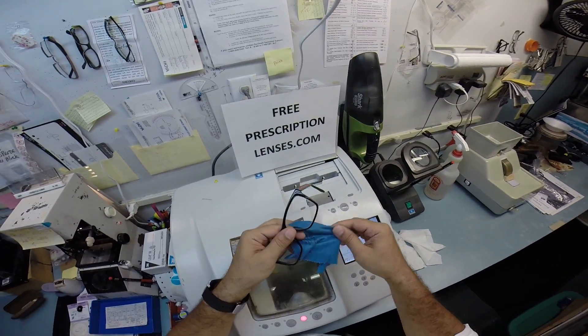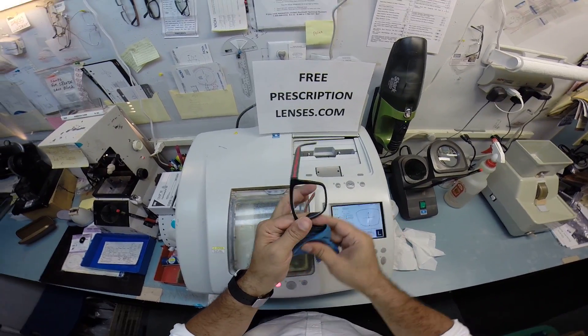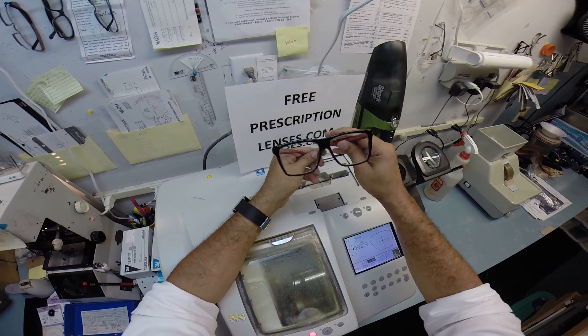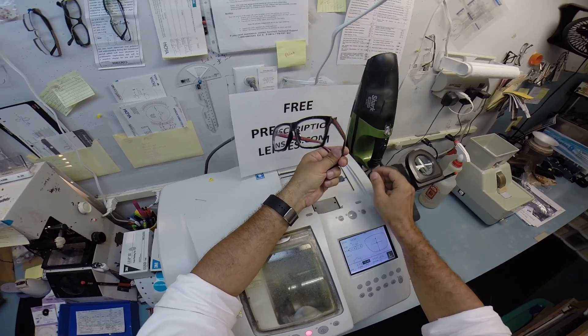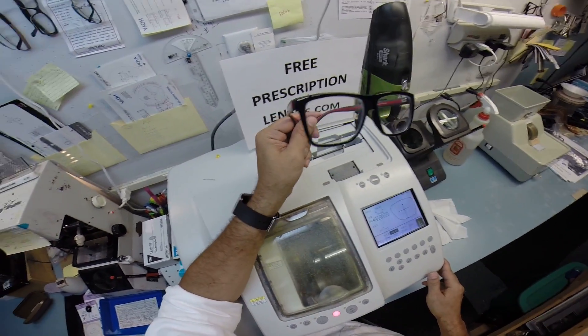If anyone has any questions about what I can and can't do, just email me at freeprescriptionlenses@gmail.com. Nick, I hope you enjoyed watching me make your first pair of prescription lenses for your Guccis. Stay tuned as I cut the sun lenses for the same pair, and everyone else gets a chance to see how I bring that love and feeling back to glasses.